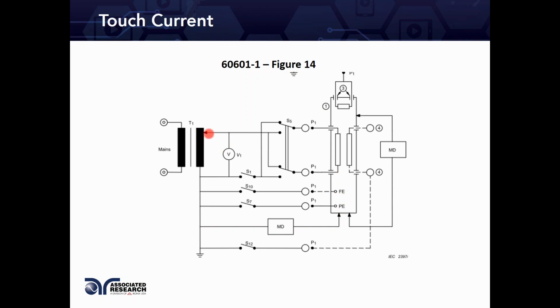So what we're measuring is leakage. Line voltage comes into your product, going back to the neutral side to power up your product, but any excessive leakage through the insulation that's being caught on the chassis with an open ground can't flow that way because S7 is open. It's going to flow through a measuring device that's in place. Now, if this leakage current is more than 5 milliamps, 10 milliamps, your product does not qualify under the standard.